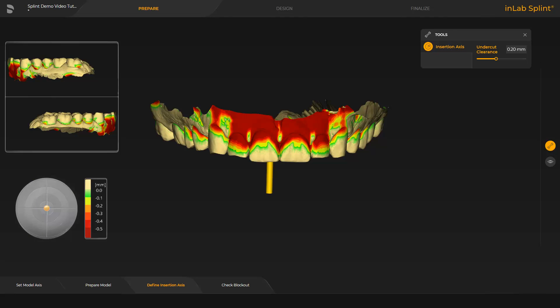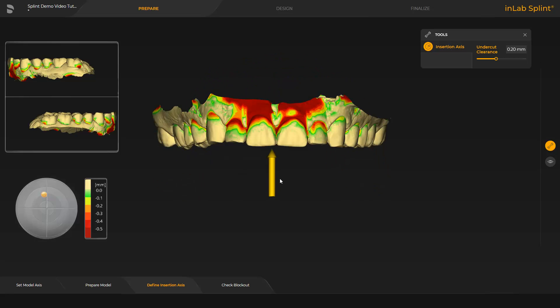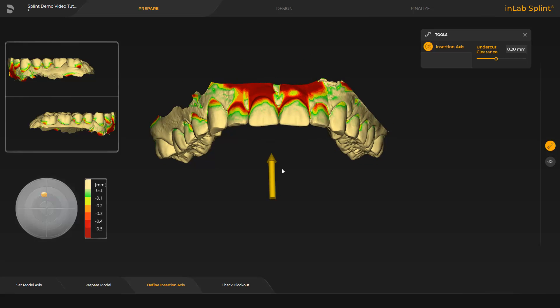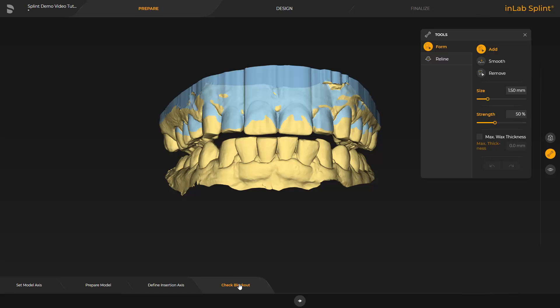When designing splints, you use the parameter undercut clearance to specify how deep the edge of the splint should be in the undercut. Here, the blocking can be checked. This was done using the setting in the insertion axis. For a splint, the interdental spaces are blocked out up to around 2 millimeters.